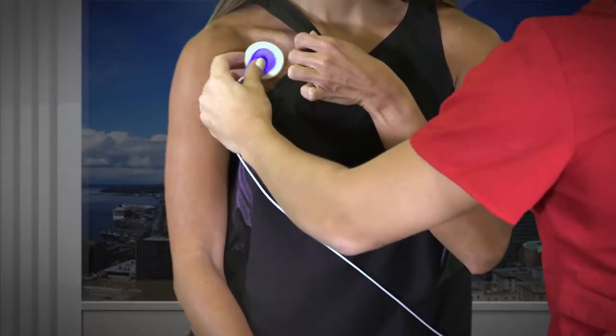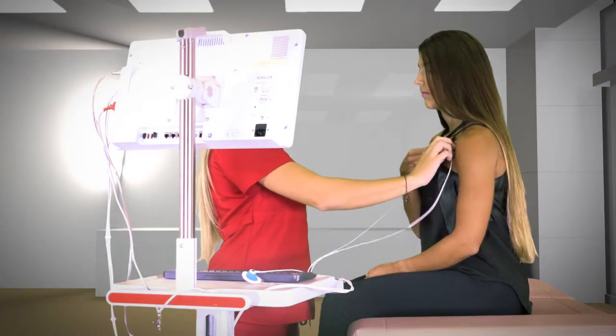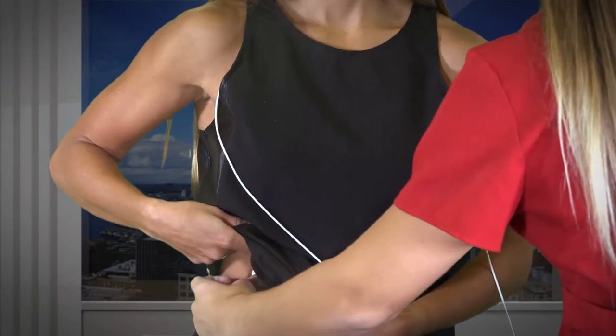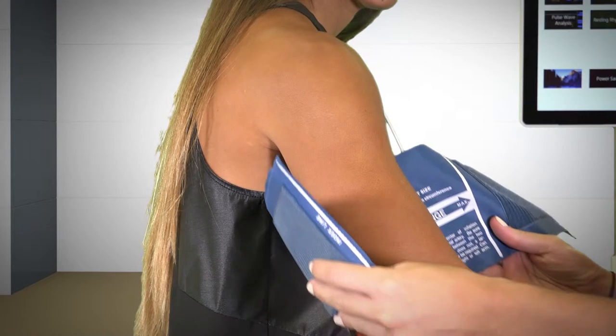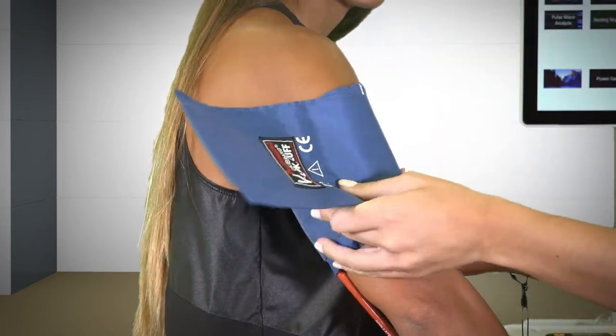The DS20 immediately detects connected sensors and automatically displays the corresponding value. In this way, parameters can be easily added or removed.